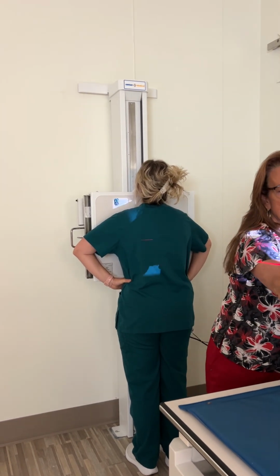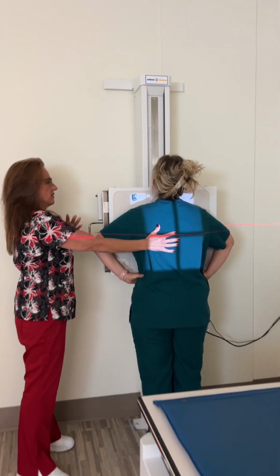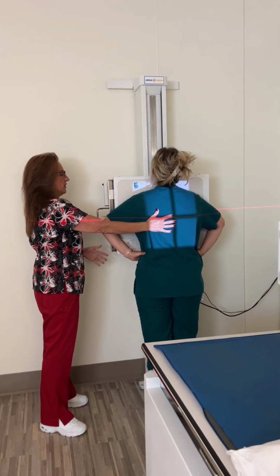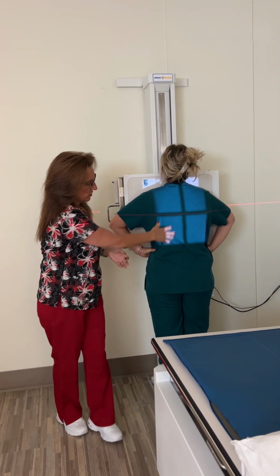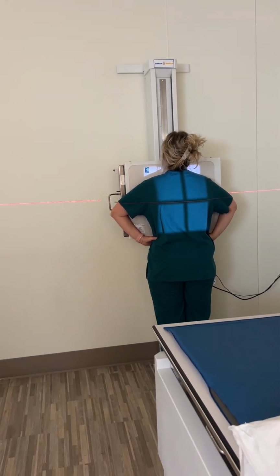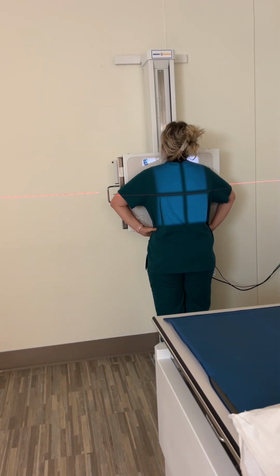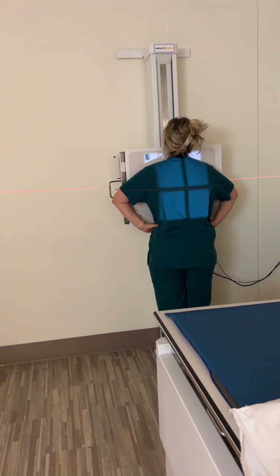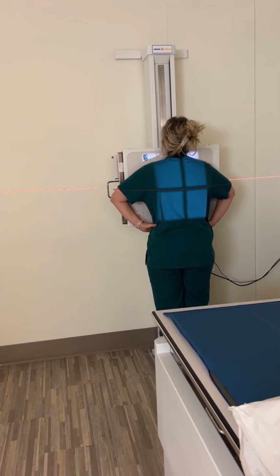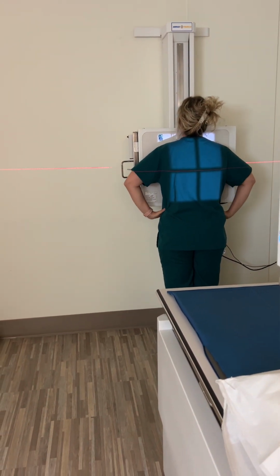And then what I am going to have you do when I tell you, I'm going to have you take in a breath, and then you'll blow it out, and then you'll take a second one in and hold it, okay? All right, I'll tell you when to stay just like that. Go ahead, take in a nice deep breath. Blow it all out. One more deep breath in. Hold it. Beat. Good. You can breathe and relax.